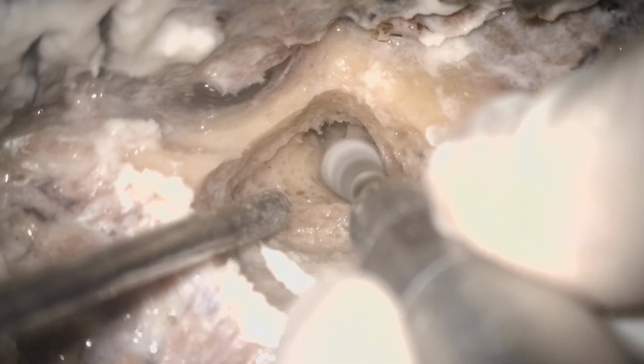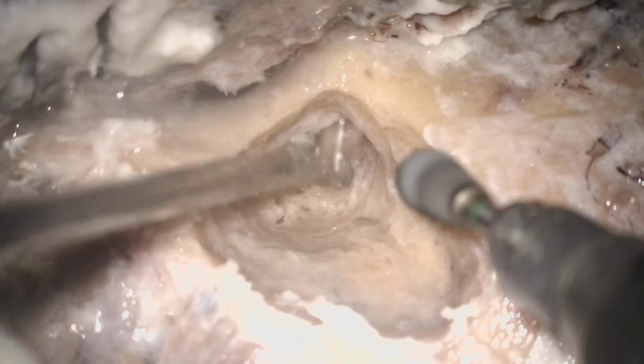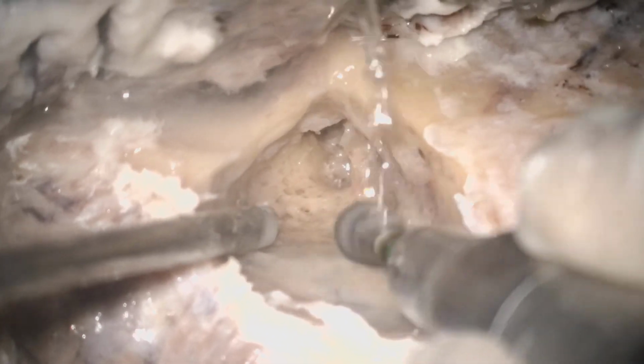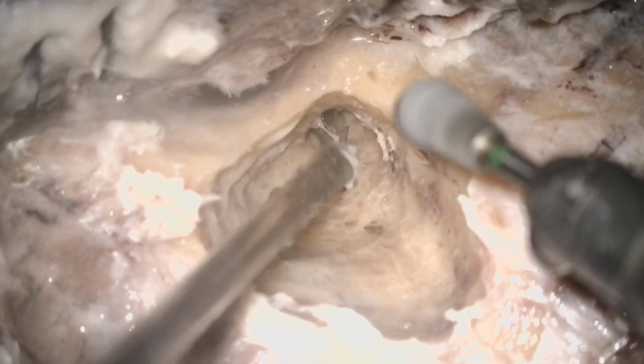Sometimes we see a septum-like structure or a straight bony septum lying over the mastoid antrum, and you will be thinking whether you should go medial or drill it or not. This dilemma will come if you don't have the CT scan beforehand. If you have the CT scan, then it will be very easy to understand that yes, it is a corner septum, and you can define the actual level of the mastoid antrum.